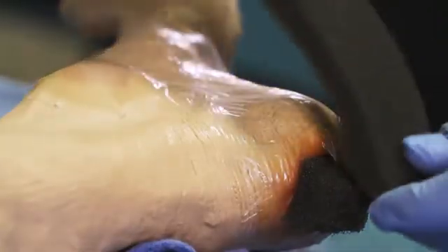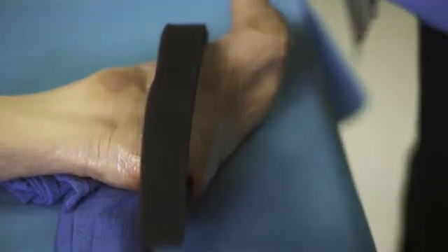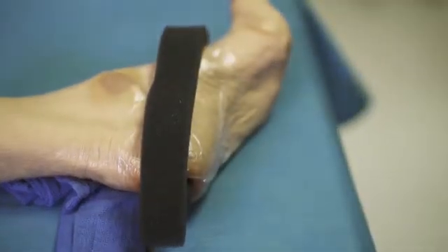Cut another piece of foam in the shape of a letter C. Place the C-shaped piece of foam around the foot extending from the wound to the lateral aspect, and ensure that it contacts the foam dressing in the wound.